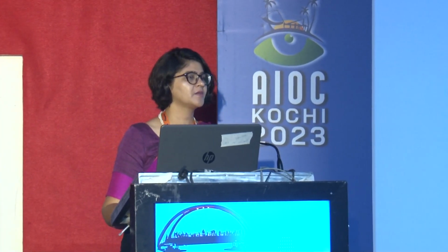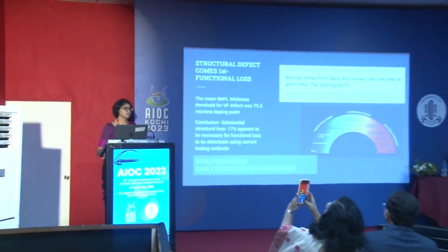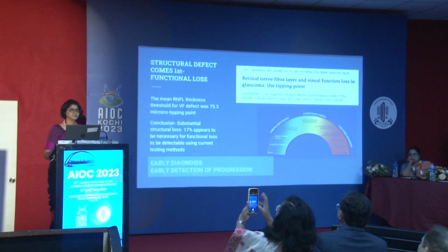So good morning, everyone. We've been using OCT in glaucoma now for over a decade, and I think the role has become quite universal after the initial hitch. Initially, there was a lot of focus on the RNFL, but gradually we are now seeing that the GCC is also becoming very important, particularly when we are dealing with early glaucoma. We all know that structural loss comes before the functional loss, as is seen by many studies.